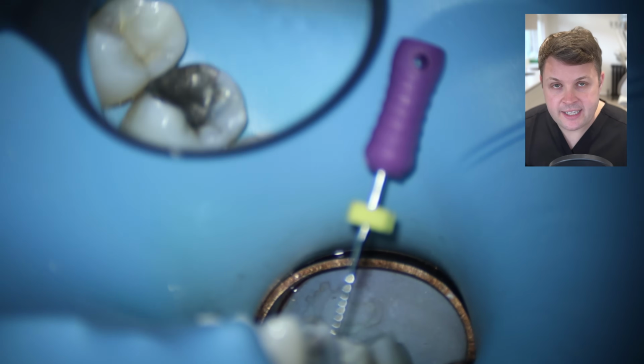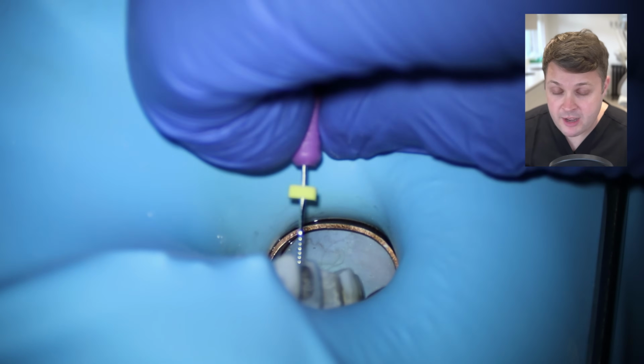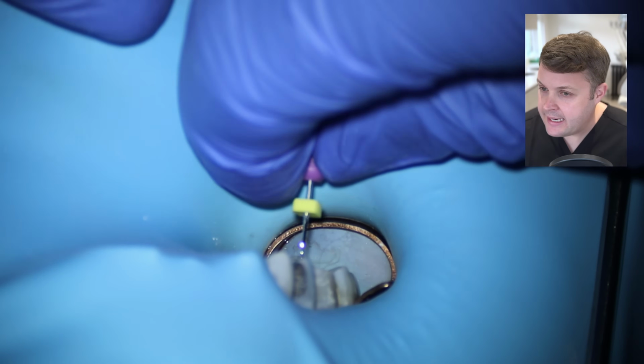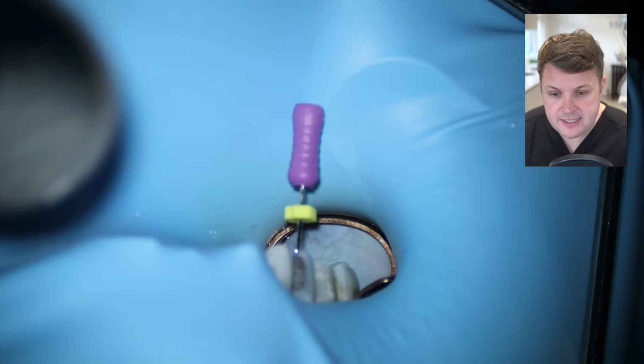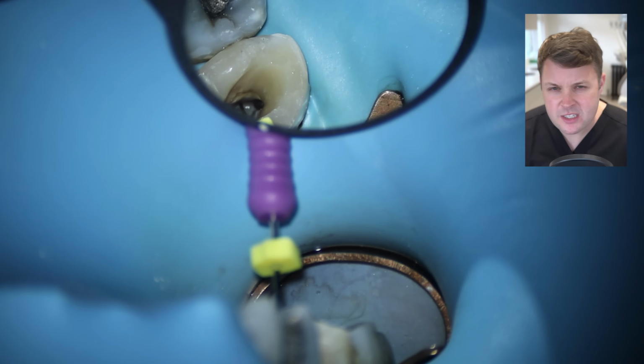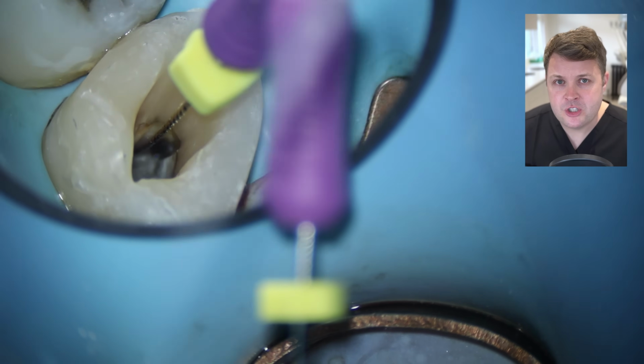We're going to just do that kind of gentle watch winding. I'm not going to ram this hand file down because I don't want to snap the file. I don't want to cause any ledging, and I just want the hand file to reach nicely to length or to the joint. And notice there's a bit of resistance there. And again, I'm going to try and work out if the two canals join.